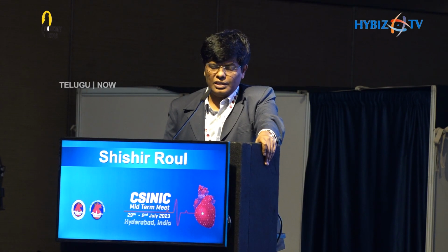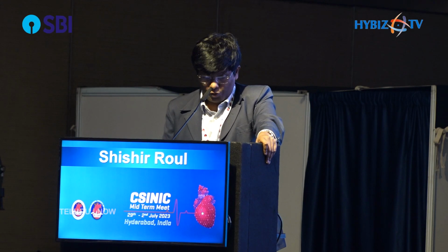Then I go there. Then the question comes to me: what went wrong at the distal edge? Why did I get a stent edge dissection? So poor bed preparation, yes. I landed the stent in a significant plaque area, eccentric calcium, or attenuated plaque or calcified plaque, and overstretching of the vessel could lead to this.